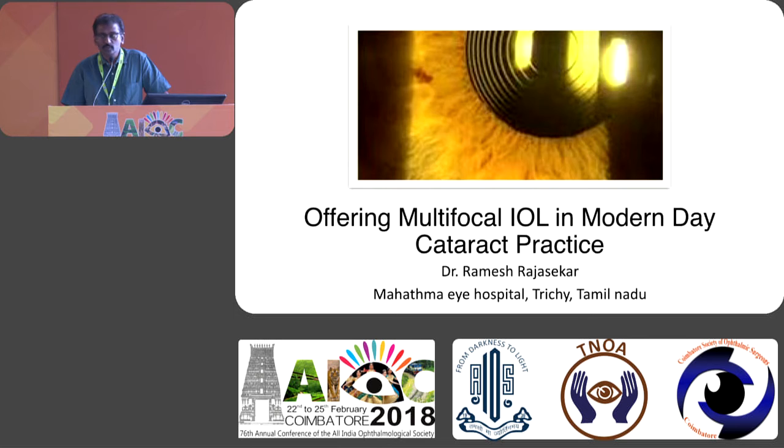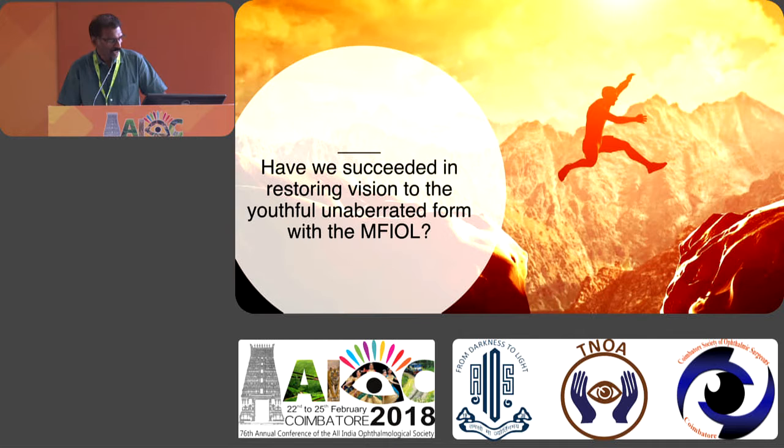When it comes to multifocal implantation, it is just understanding the need of the patient, the elderly patient, what exactly the visual needs of their day-to-day requirements and lifestyle are, based on which the whole multifocal lens concept is developed. Have we reached the summit of it? Not yet. We still have a lot of issues to be discussed. We are seeing an eye where the spherical aberration keeps changing with age, so we need to address so many issues when you come to multifocal lenses.